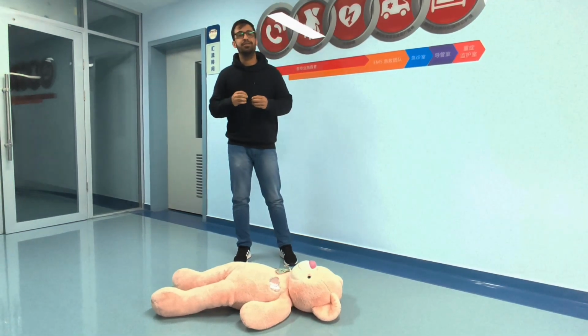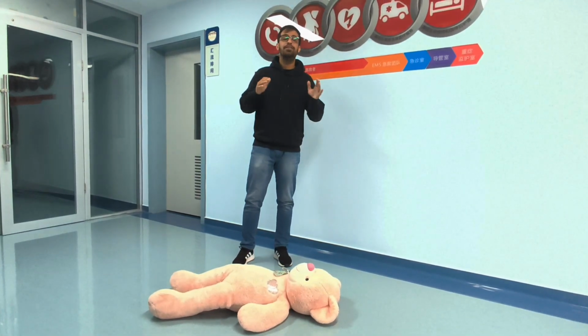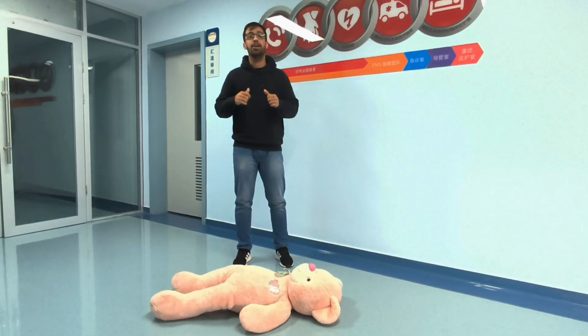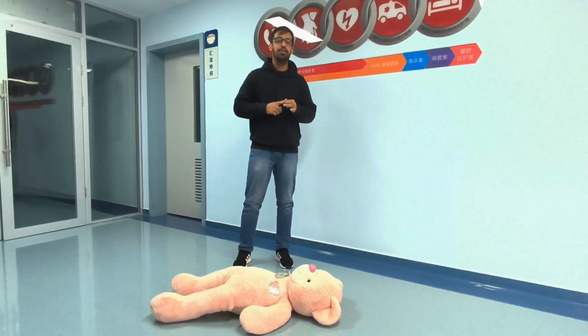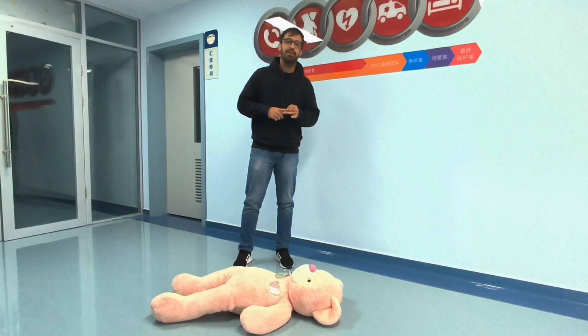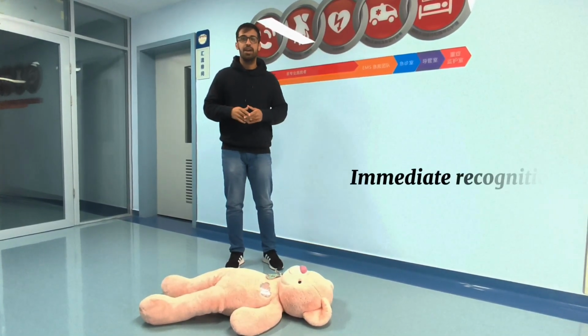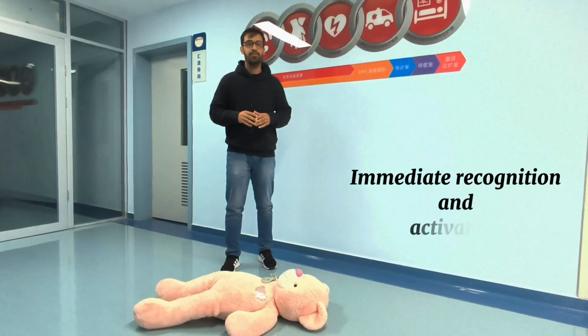Welcome everyone to our CPR training session today. We will simulate the entire process of how to give CPR, including chest compression, establishing an open airway, and defibrillator. First, we will need to assess the situation and the environment, ensure that it's secure and safe.